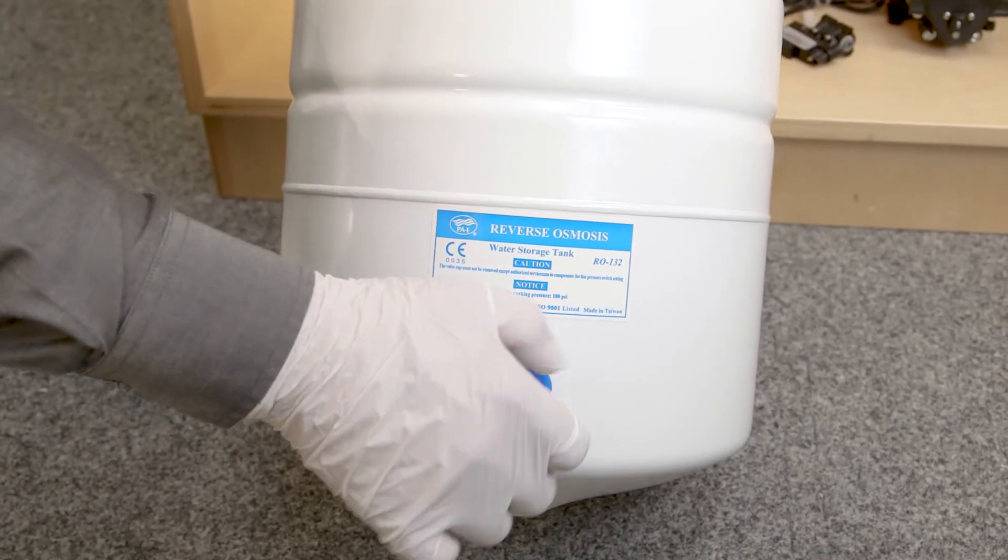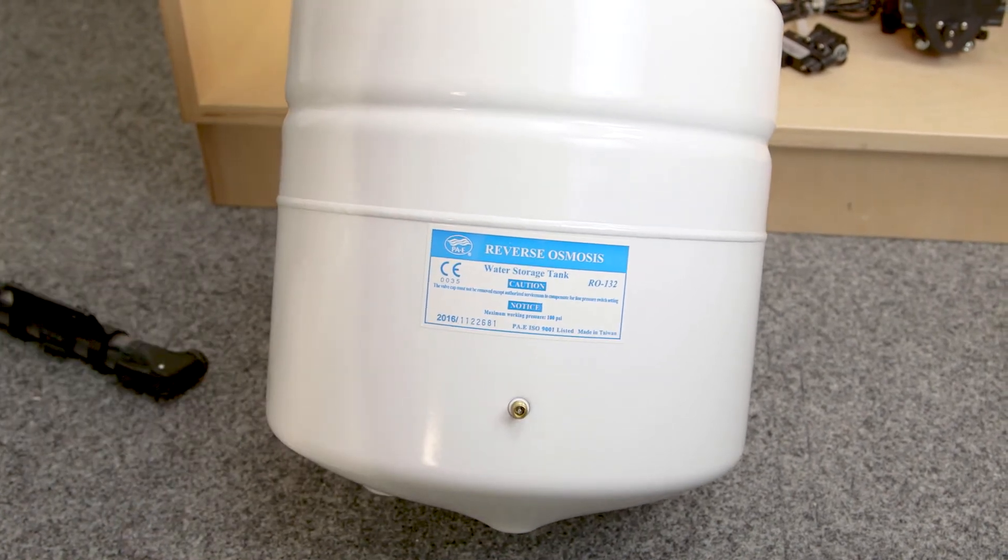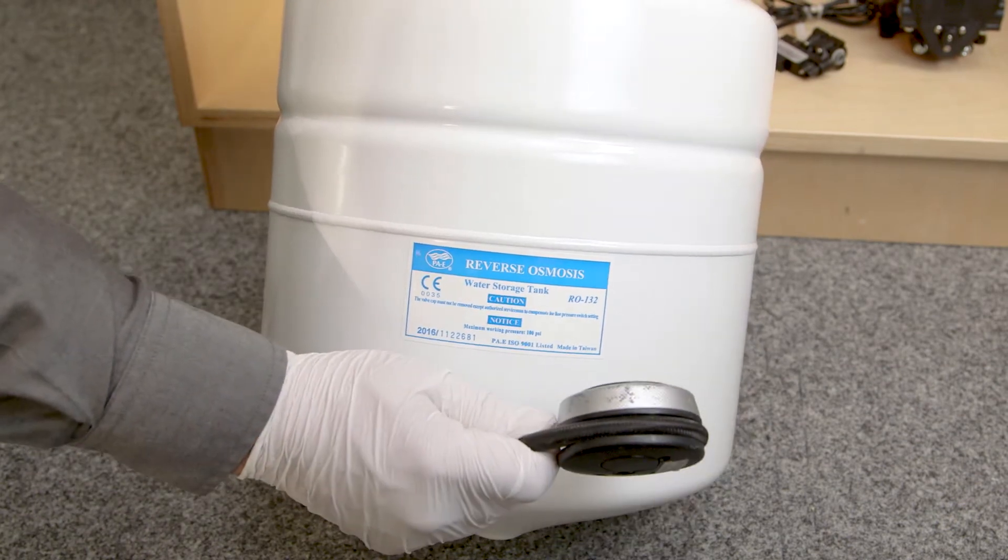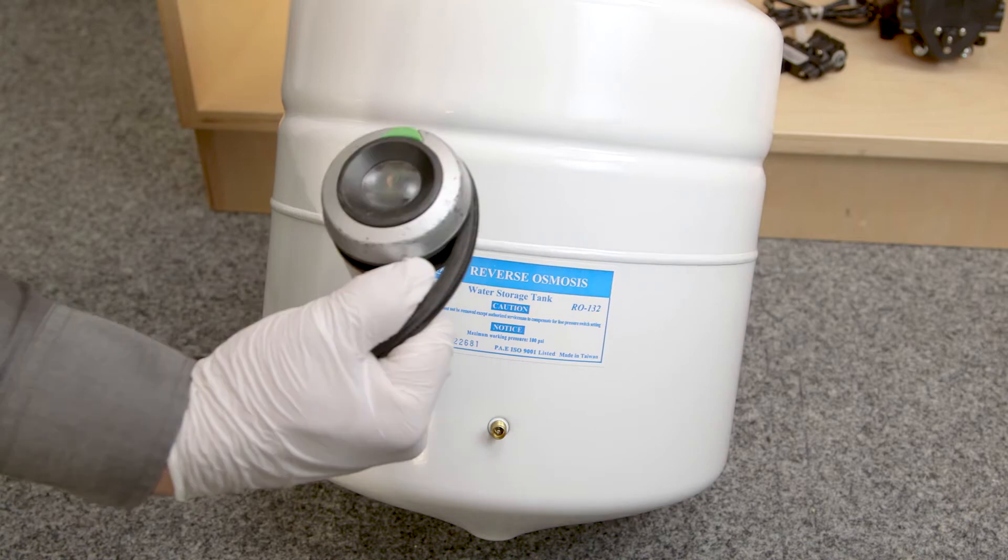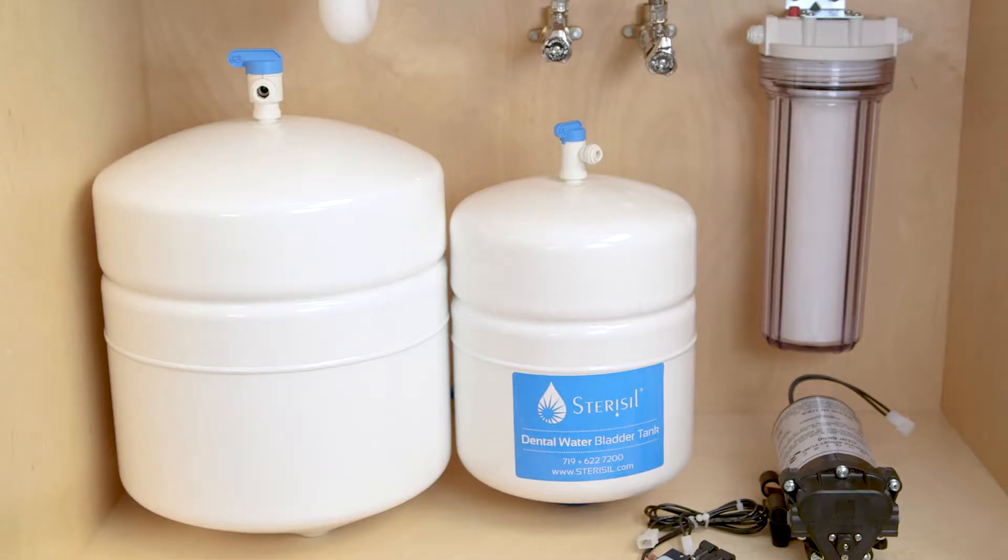On the tanks, you'll find a plastic blue cap. Rotate it counter clockwise to remove it, exposing the Schrader valve. Verify the pressure is between eight and ten psi. If they're not within that range, you'll need to add or remove air with your low volume air pump. Your tanks are now ready for plumbing.